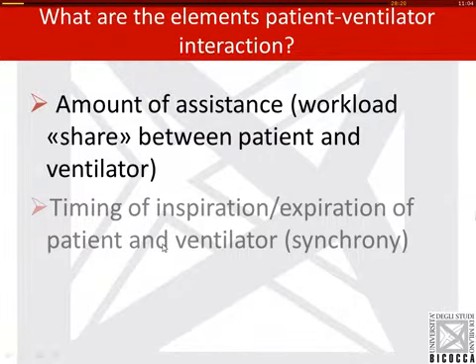And the second part of my talk, a bit larger, will be about the timing, the synchrony between the inspiratory time of the patient and the inspiratory time of the ventilator, and also of the expiration of the two, so that the two times are synchronized. So let's start with the first one.